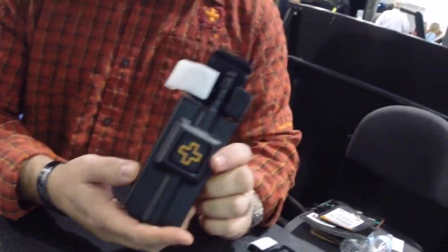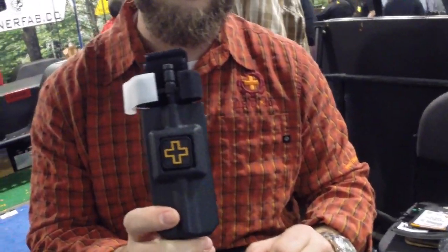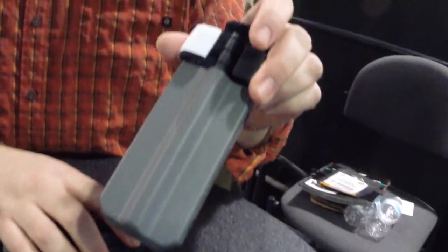They're available in cross front if you want a medical identifier. This one here is used quite a bit across the country by law enforcement on their duty belts. And then we also have the slick front if you don't want the cross identifier.